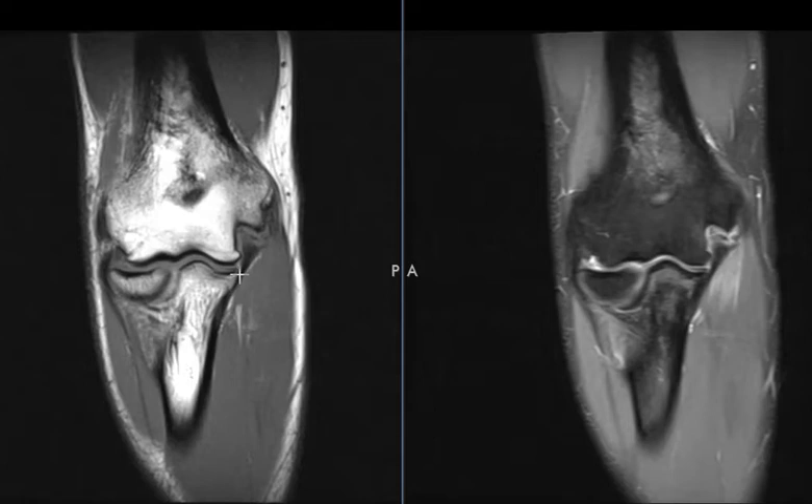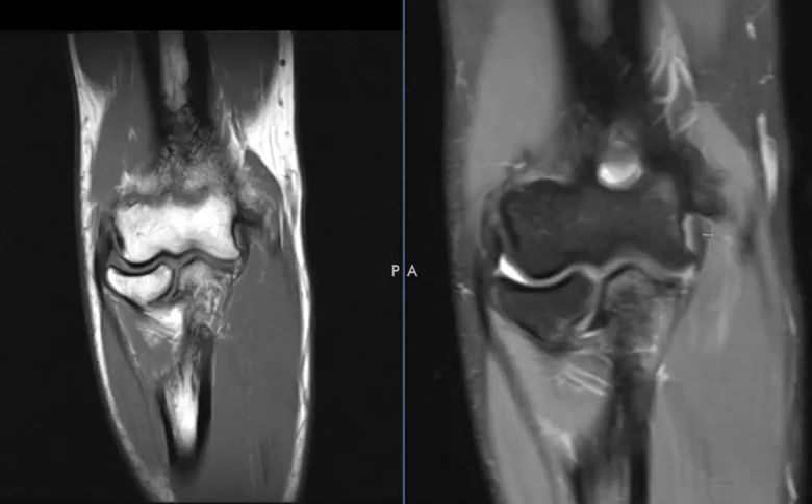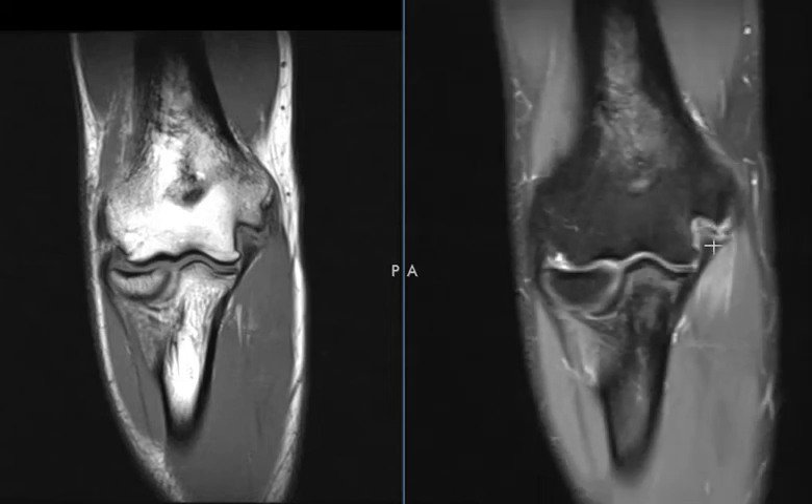You can see right here the dark ligament — it comes from this little pointy part called the sublime tubercle, it comes up and should attach right here to this shelf, but instead it's torn and retracted down about four millimeters. You can see it better over here, and there's some dark irregularity here — this is the periosteum that's torn and pulled off. So this is a torn posterior band of the ulnar collateral ligament from the medial epicondyle.